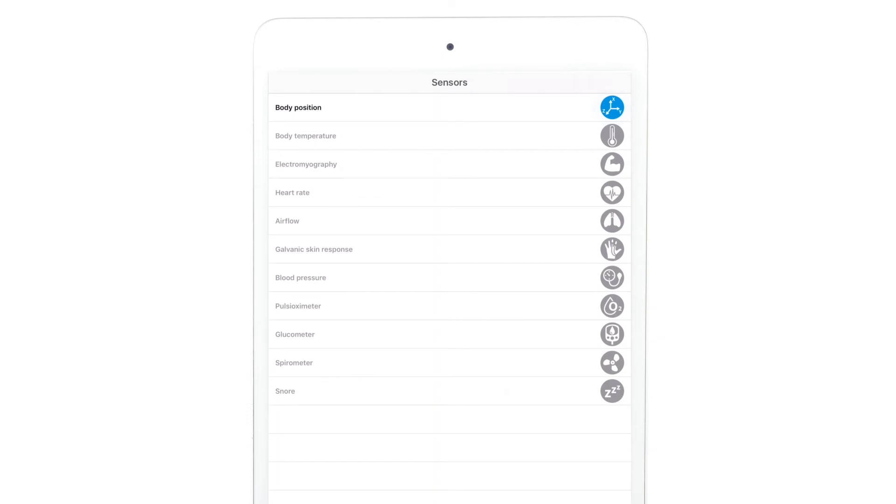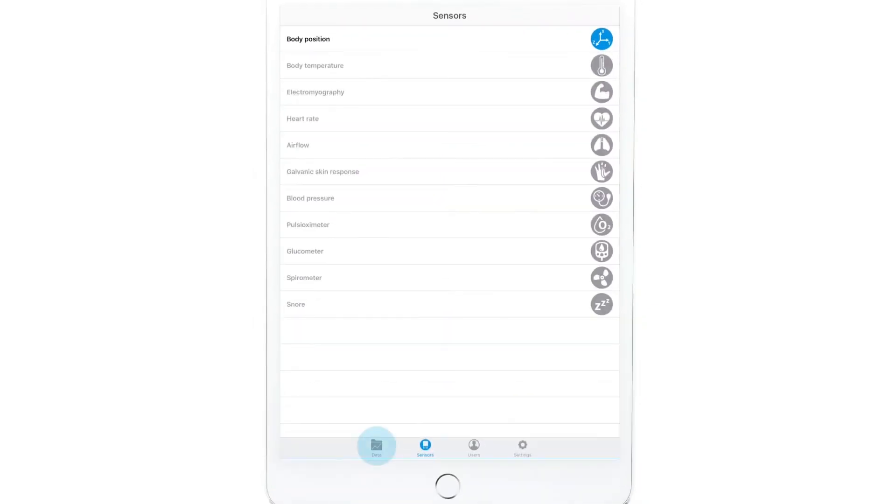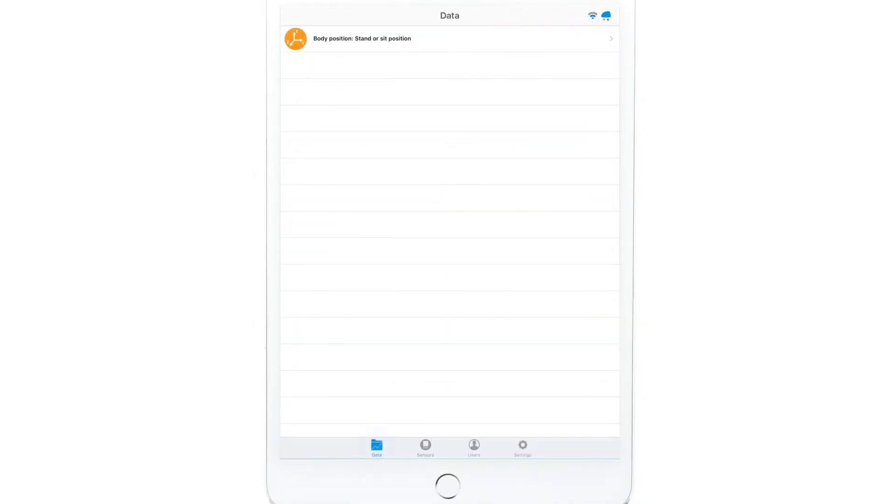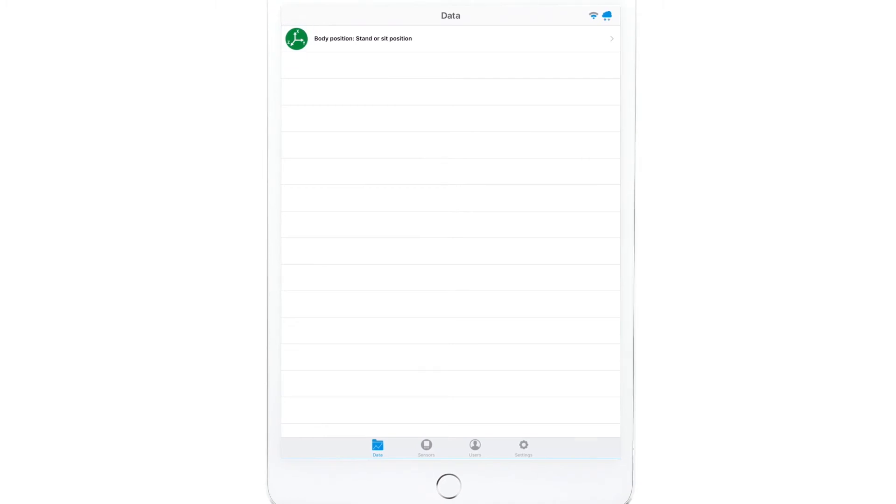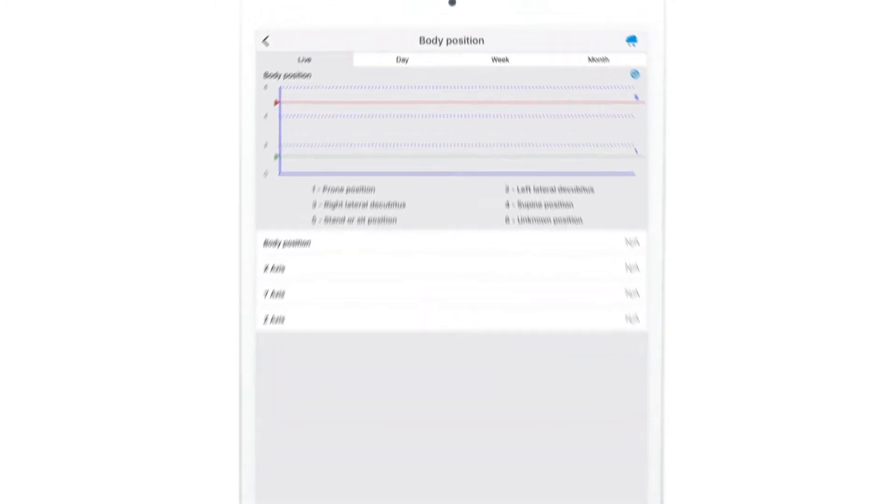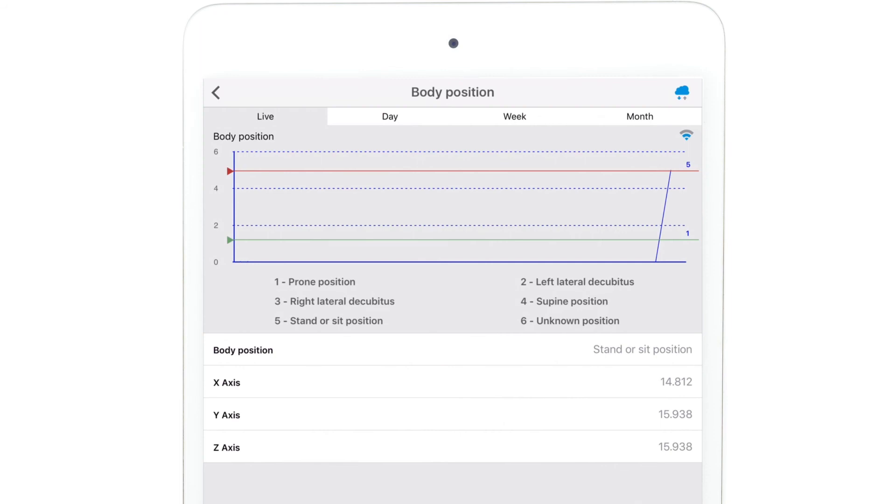Once you have selected the sensors you want to measure, return to the Data screen. There you will see the sensors previously selected. Tap on one of them to start real-time data visualization.